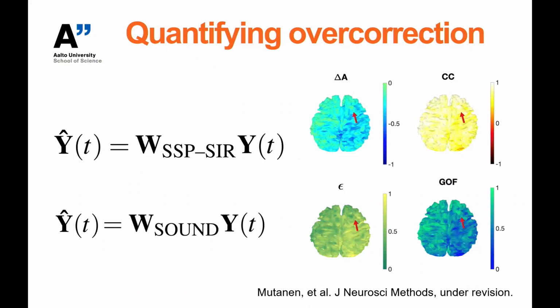And you basically get a map that shows how much overcorrection you have as a function of cortical location. Oftentimes, if you have, for instance, big muscle artifacts in TMS-EEG, it means that close to the stimulation site you suppress those sources quite a bit. But on the flip side, if you are interested in mapping causal connections, especially to the contralateral hemisphere, the story becomes a little more optimistic. We can often see that on the contralateral hemisphere the sources are much less suppressed. So even in difficult cases, you might see a shed of light that maybe you can measure the connection to the remote areas of interest.